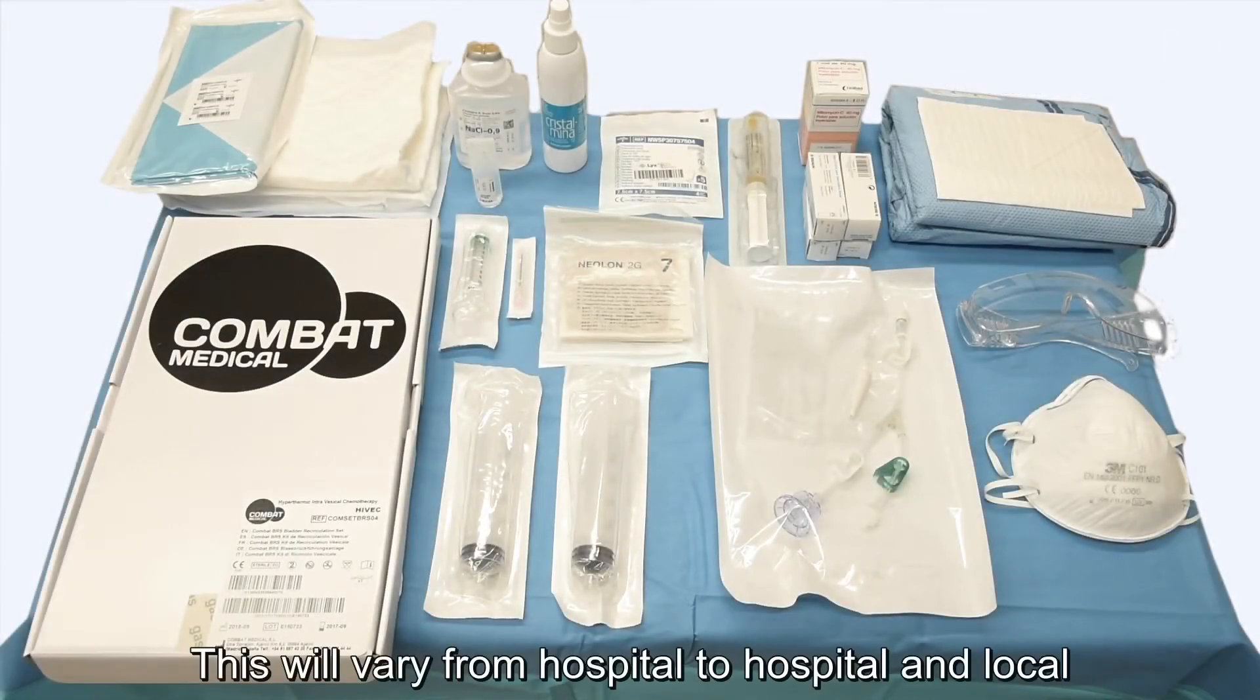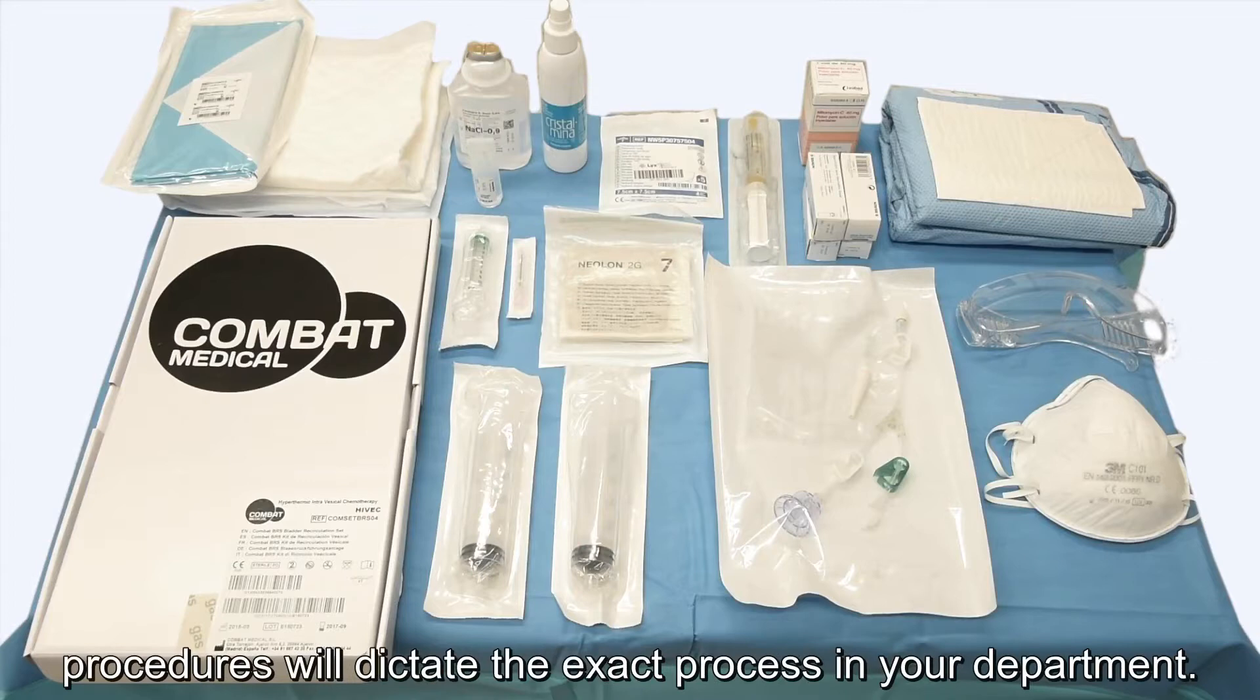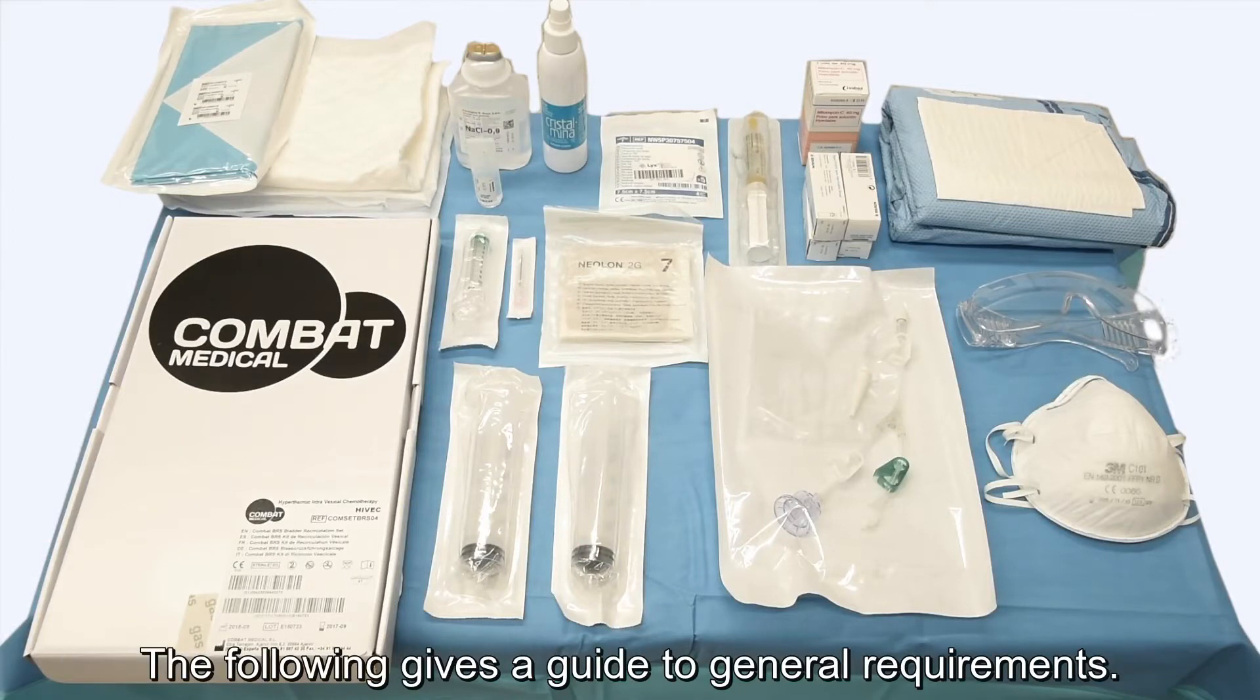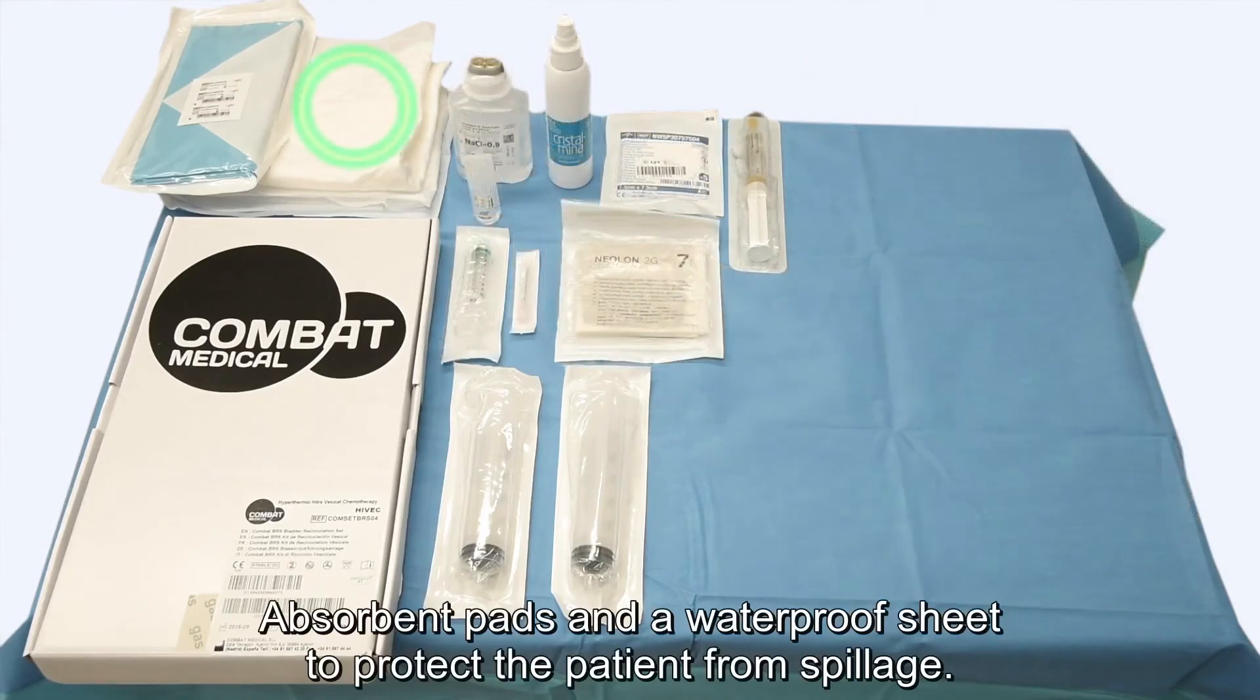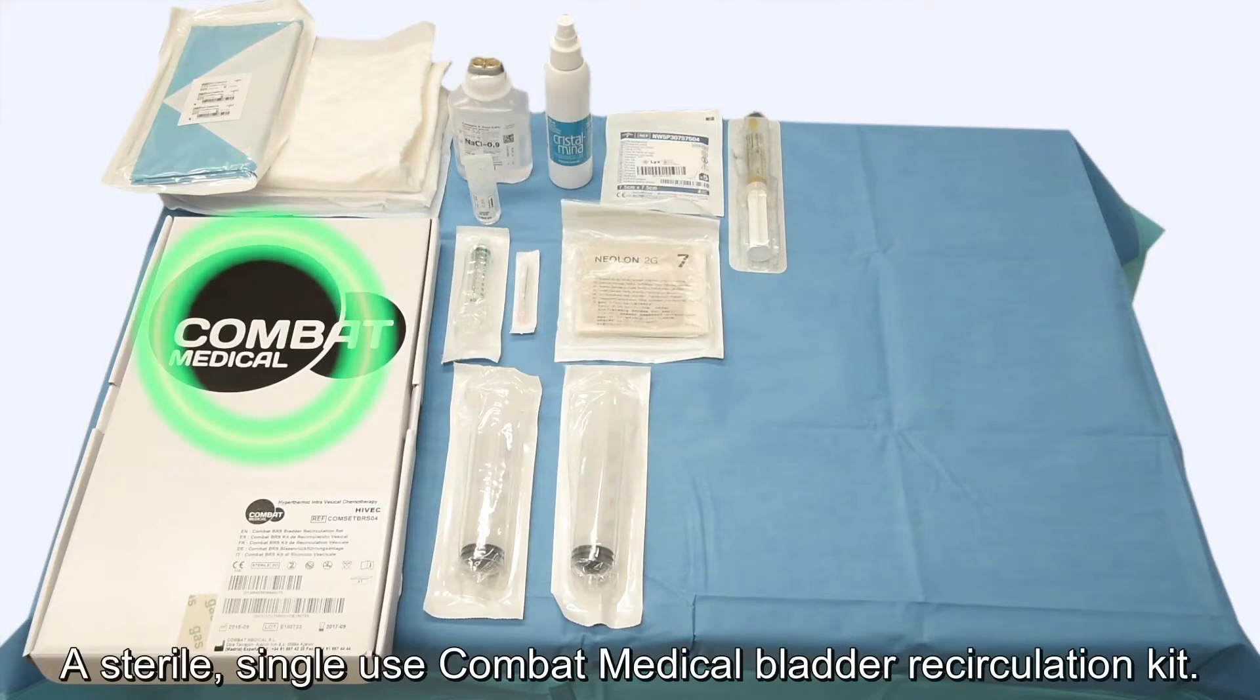This will vary from hospital to hospital and local procedures will dictate the exact process in your department. The following gives a guide to general requirements. Absorbent pads and a waterproof sheet to protect the patient from spillage. A sterile single-use COMBAT Medical bladder recirculation kit.